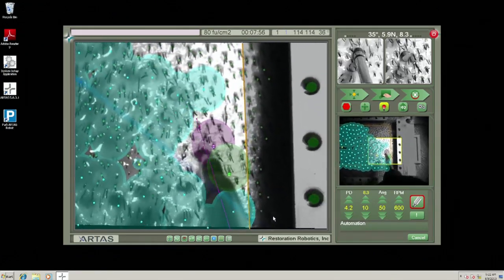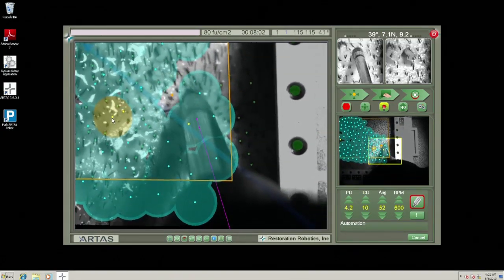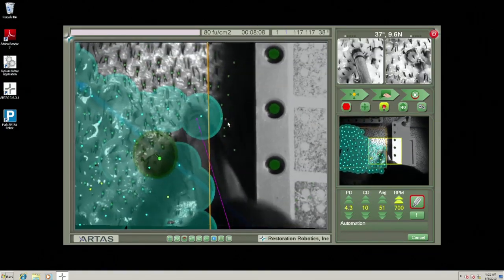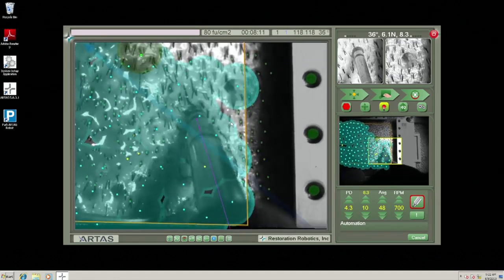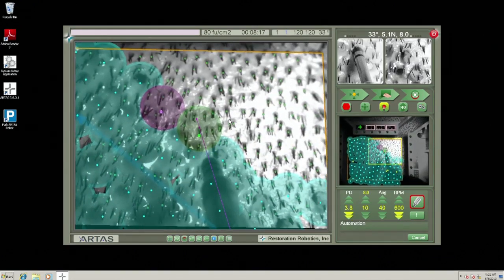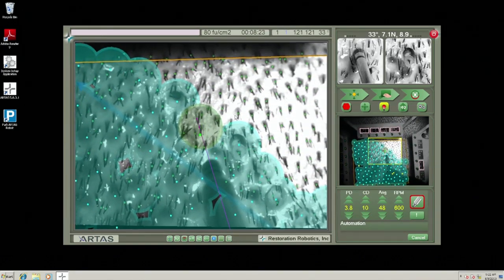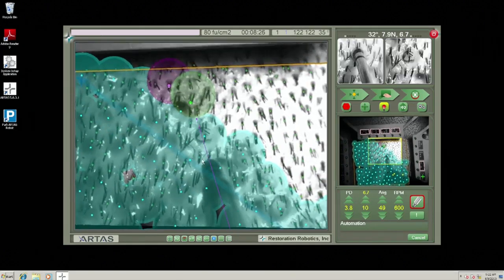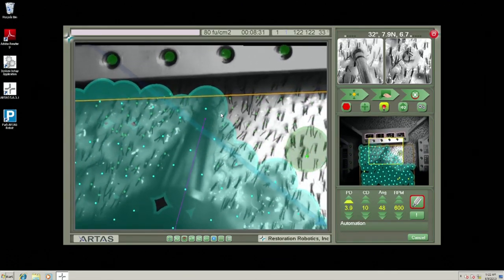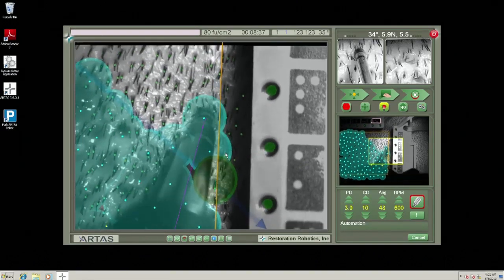Now I can direct the robot to go down and take certain grafts. I can also tell it, let's not dissect, by putting a yellow dot. I can right click on my mouse and tell it, don't dissect in that area. So this is kind of like what my good friend Dr. Mohan, who developed this system, described as having a car in auto, sort of a cruise control, but yet you can still tap the brakes. You can still tell the car, I'm going to turn right, I'm going to turn left, but nevertheless, you can put it in some degree of an automation mode, which is happening before your eyes right now. The computer is deciding where it wants to go.